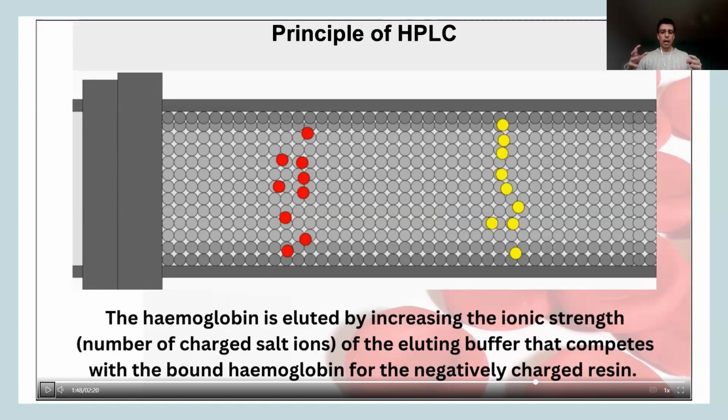And then when you have all hemoglobins captured, you need to do an elution phase. That elution is created automatically by the analyzer and is done very precisely, hence the name high performance, because it's going to incrementally increase that elution buffer to systematically detach the hemoglobins from the stationary phase, and one by one they are going to be measured.